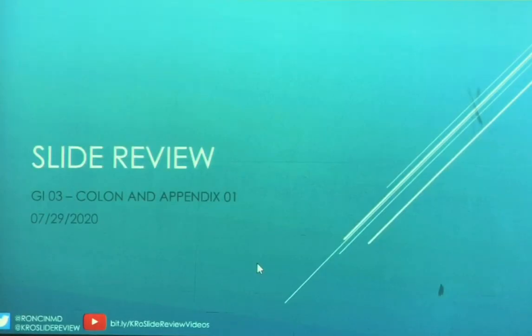Welcome to Slide Review. This week we are going back to our GI to finish out with some benign entities involving the colon, appendix, and I may have even thrown in a few lesions involving the anus as well.